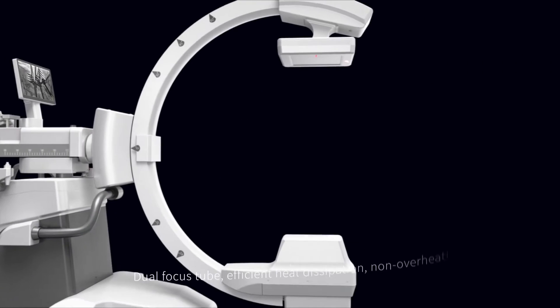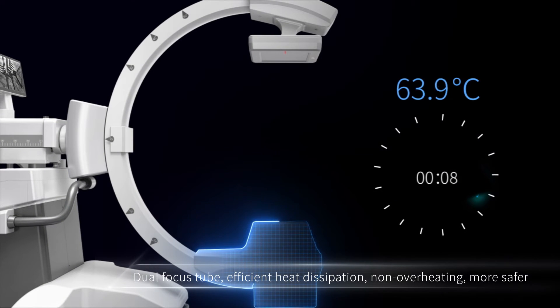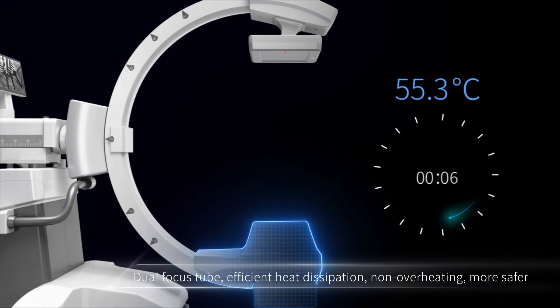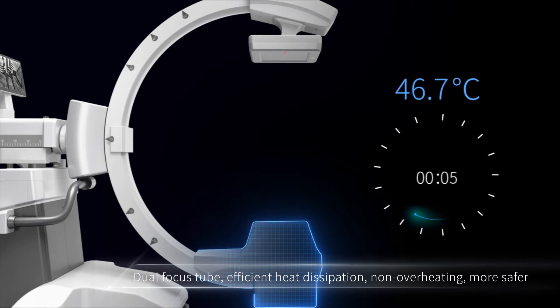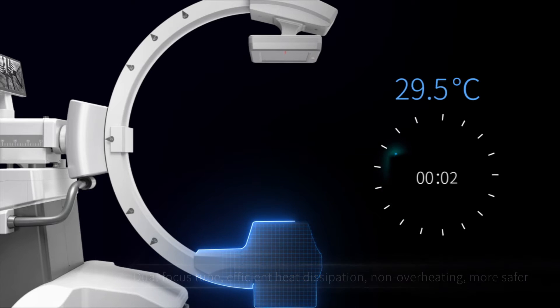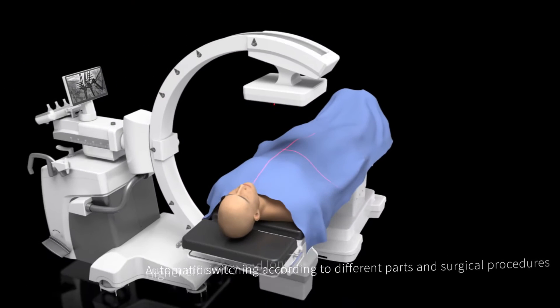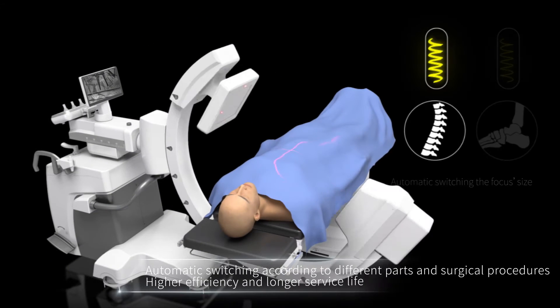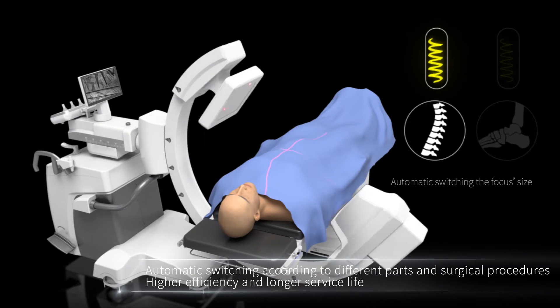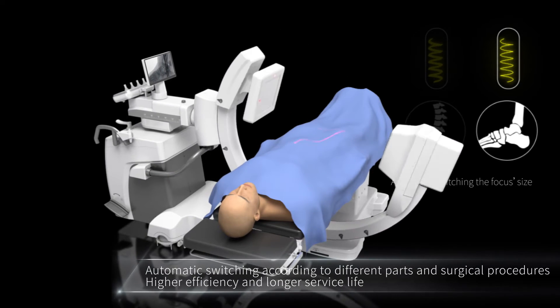Dual focus tube provides efficient heat dissipation, non-overheating, and more safety. Automatic focus size switching according to different parts achieves higher efficiency and longer useful life.